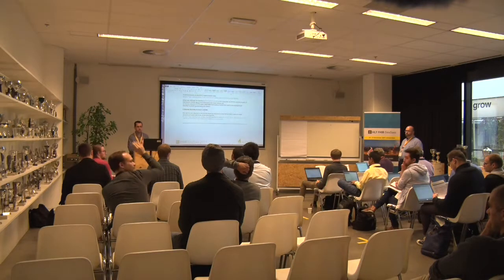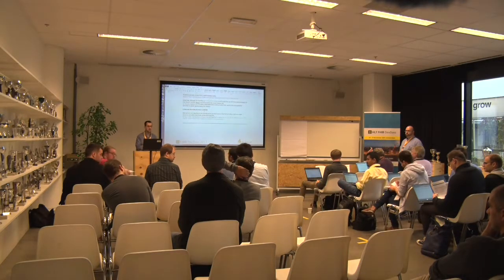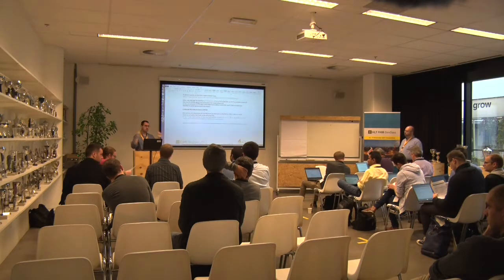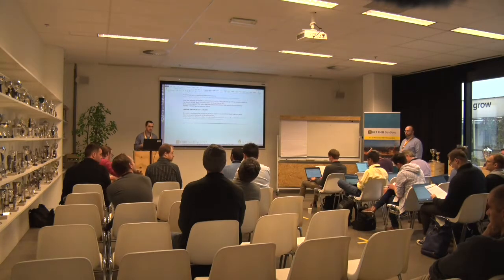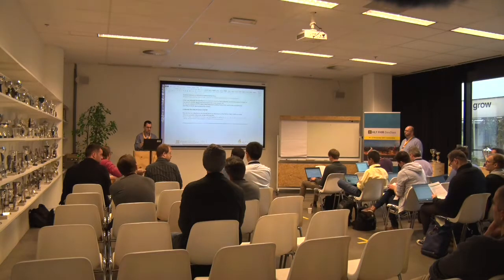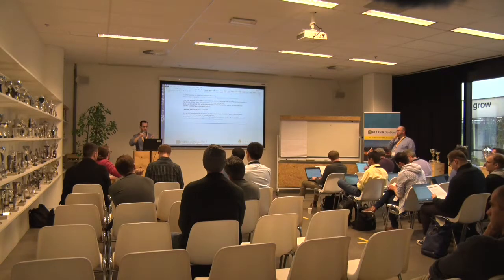So you had a question? Well, just a simple one. Can we get JSON for DICOM data as well? Yes. So both FHIR and DICOMweb speak JSON and XML fluently. It's your choice which one you prefer. Well, I tried adding JSON to the header, but it still returns XML. Some of them can be picky. You could try text, JavaScript, or application/JSON. It should respond to one of them. If it doesn't, let me know.